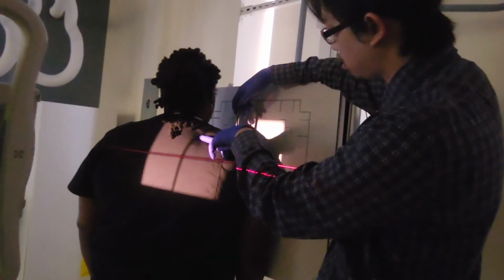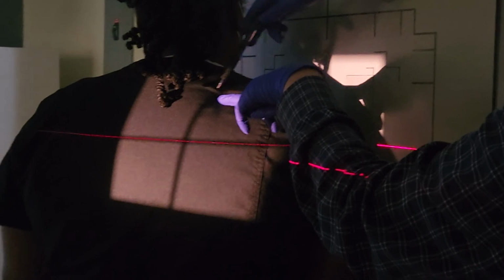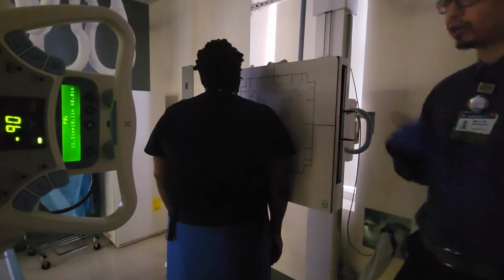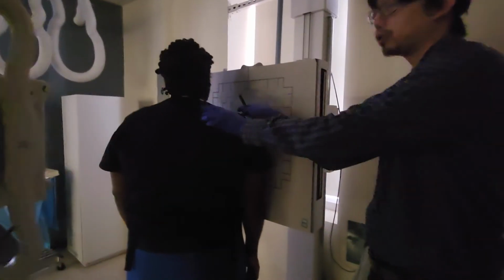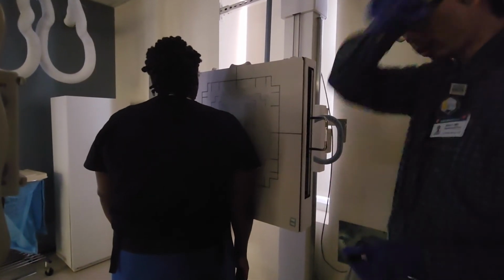Are they both on top of the central ray now? Here's our superior angle. Here's our AC, right? So central ray goes straight through both of them. That means they are superimposed on top of each other, correct? So this is the rotation I would need for Shamika to get a good Y view. This should be about 45 degrees, somewhere between 45 to 60 degrees. It's going to vary depending on your patient, so you can't just use the same angle for everyone. You need to check these two points: check the AC and check the superior angle.